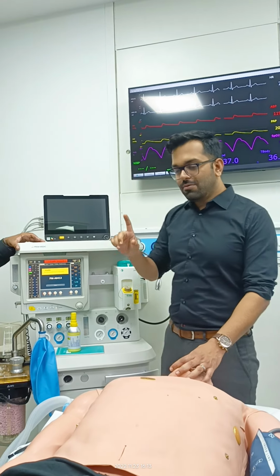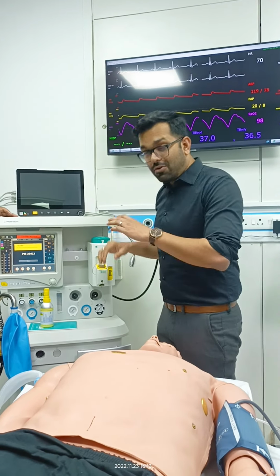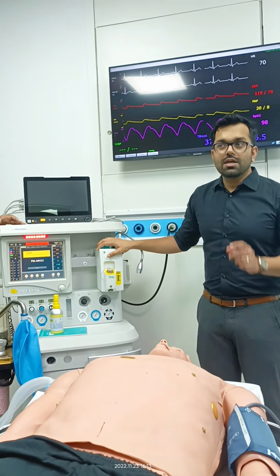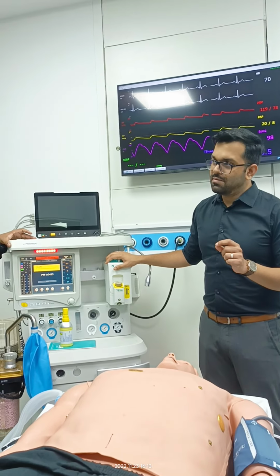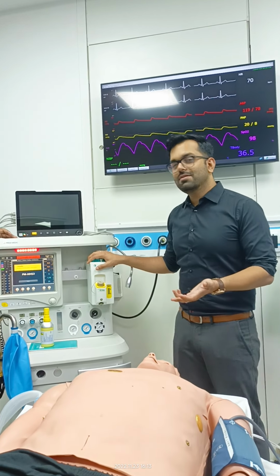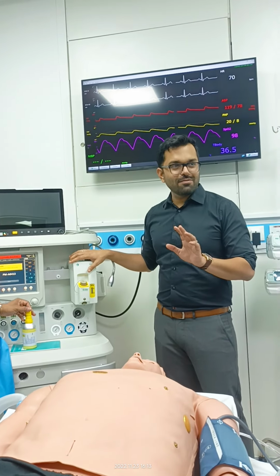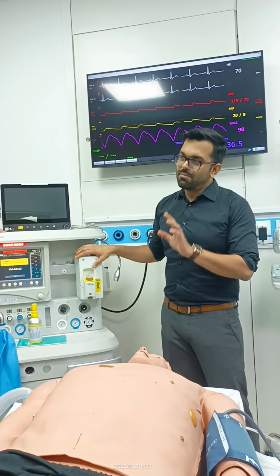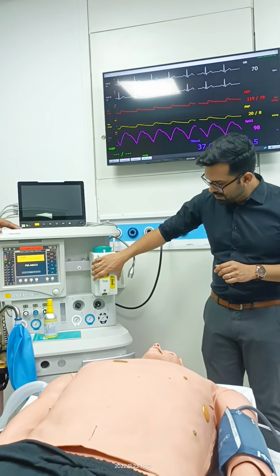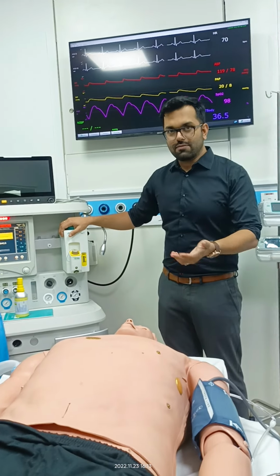So to keep the patient alive, oxygen is given. To maintain the anesthesia, we use anesthetic agents in the form of gases, but they never come in the form of gases. They come in the form of liquid. See the problem in our lives, things are not straightforward. So we use various devices like this one here to convert it from liquid form to gaseous form.